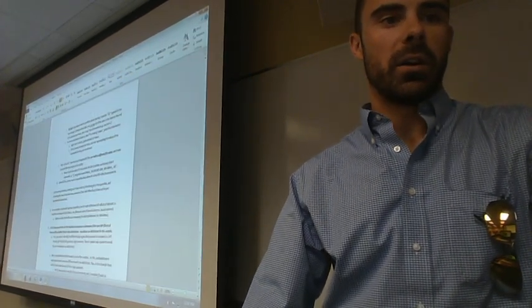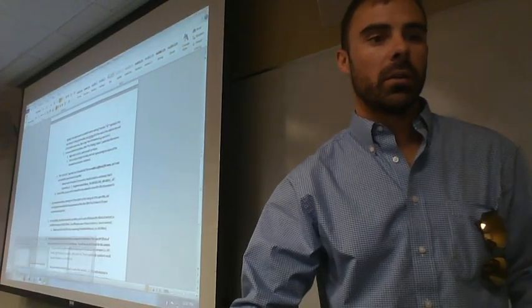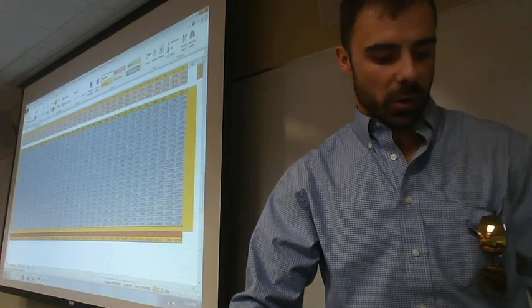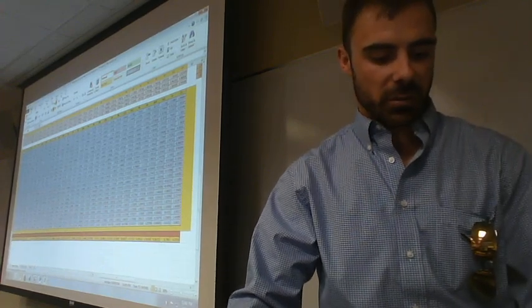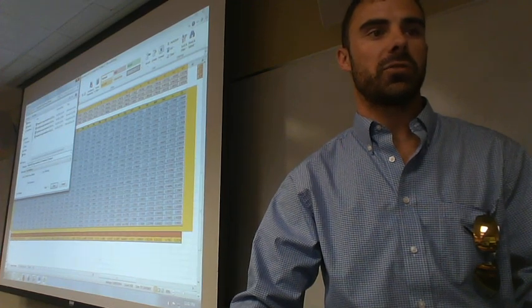Okay? And that's kind of what we talk about at this point. In the new worksheet for paste values, to do that, we want to save it. First of all, we can come back and save our template here, but you don't want to save it as the template, so you want to save it as, and of course, you don't want to say template for range normalization.